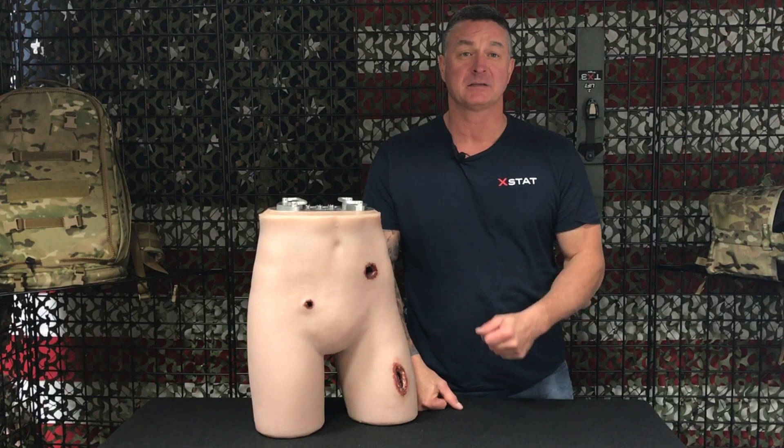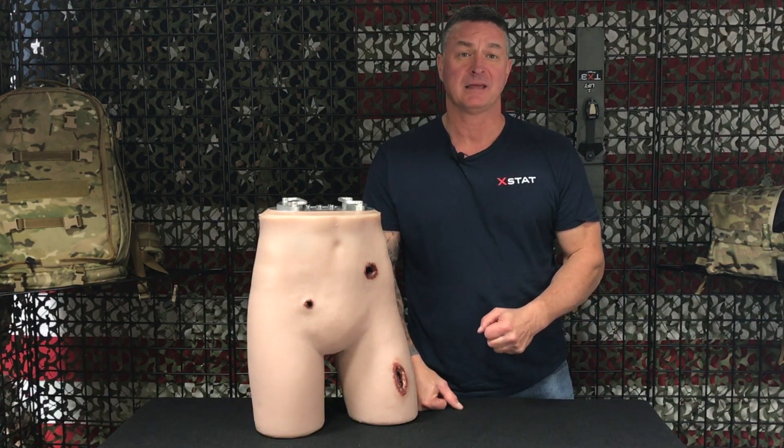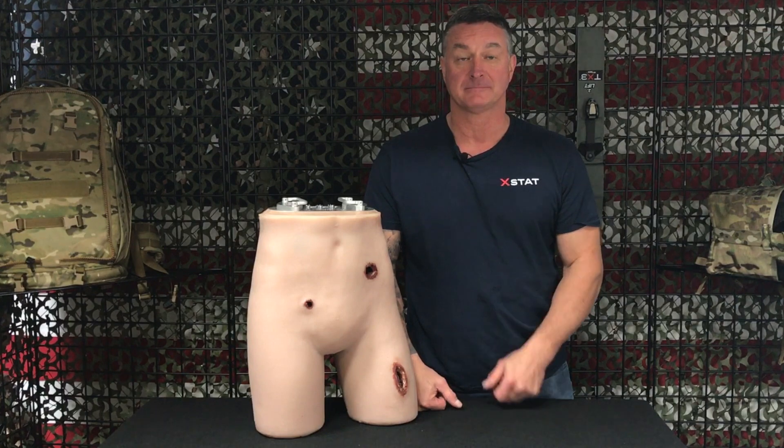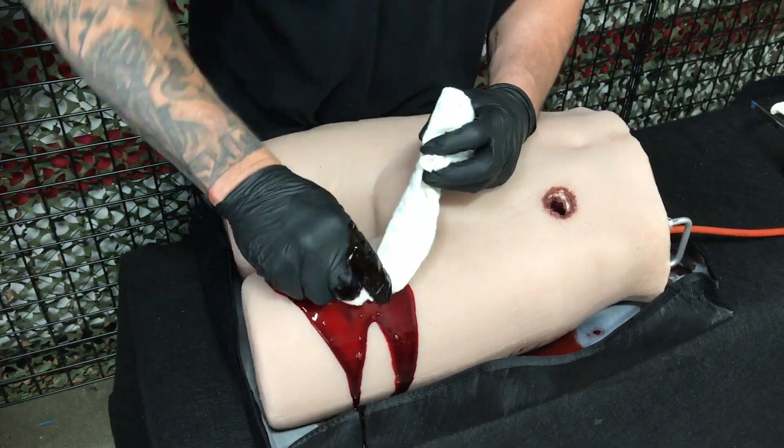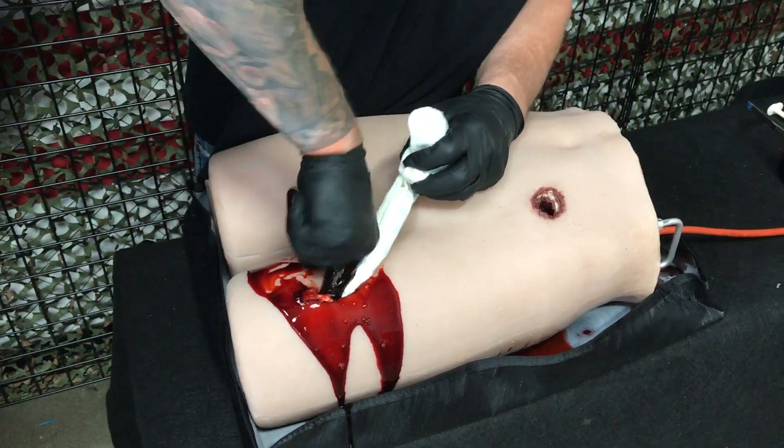Hi, this is John from RevMedics. Today we're going to go over the features of the RevMedics Multi-Task Training Mannequin. The Multi-Task Training Mannequin was designed to train with extant hemostatic applicators, tourniquets, junctional devices, and wound packing materials. Wound packing and tourniquet application are perishable skills. You must practice regularly to develop good muscle memory.